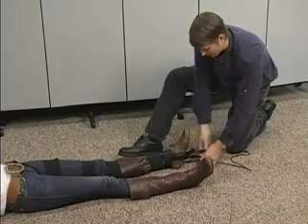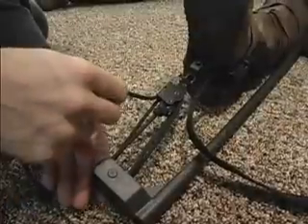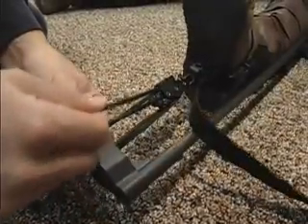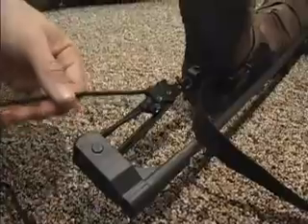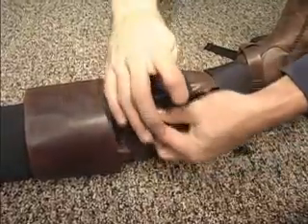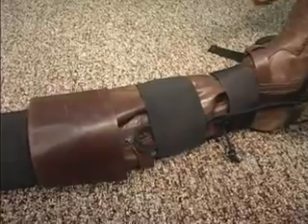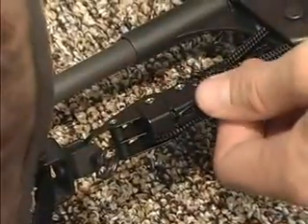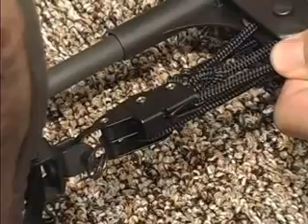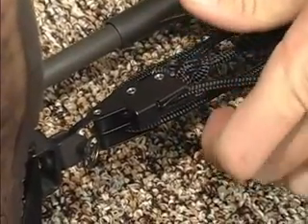The medic should position himself near the patient's foot at an angle facing the patient's face. Apply traction as needed. Once adequate tension is achieved and the line has been lifted into the V-Jam cleat, secure the loose end by tucking it under the bottom leg strap. If you have a long transport time, more traction can easily be applied by releasing the traction unit's line and then re-tightening it. To release, pull moderate tension on the line and angle it down and out of the V-Jam cleat.